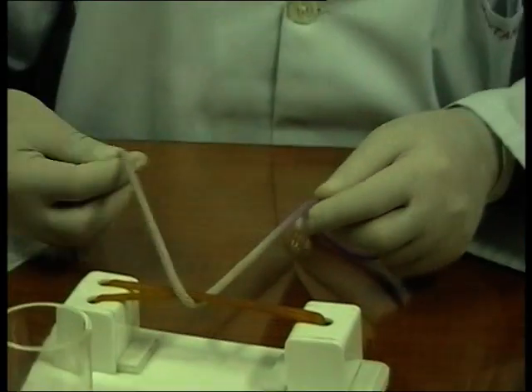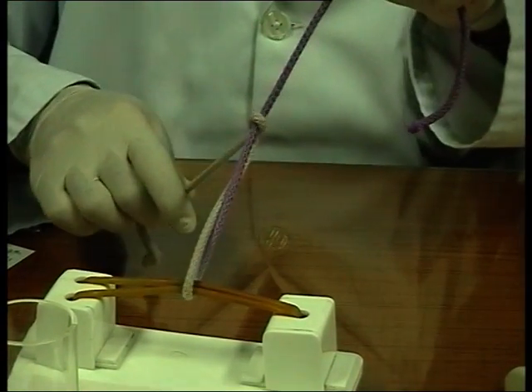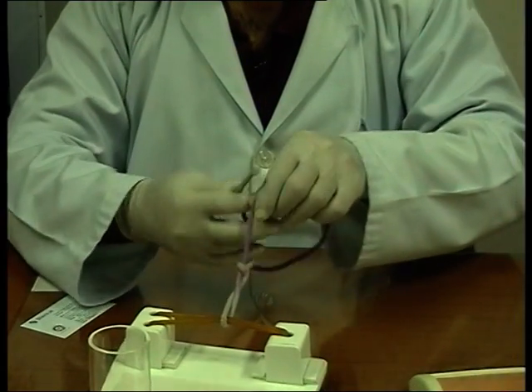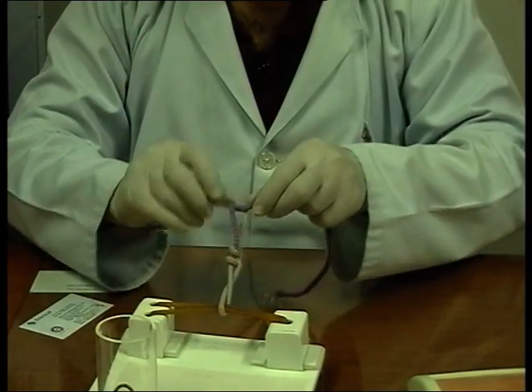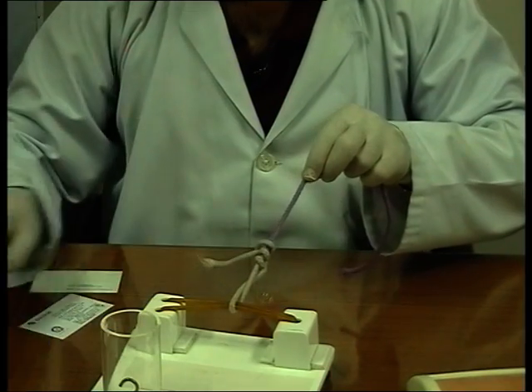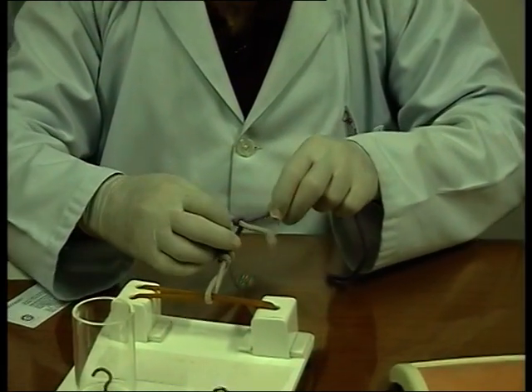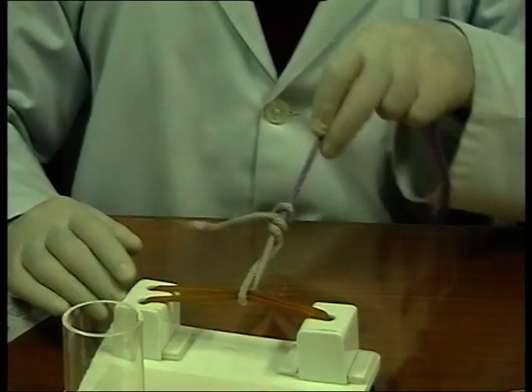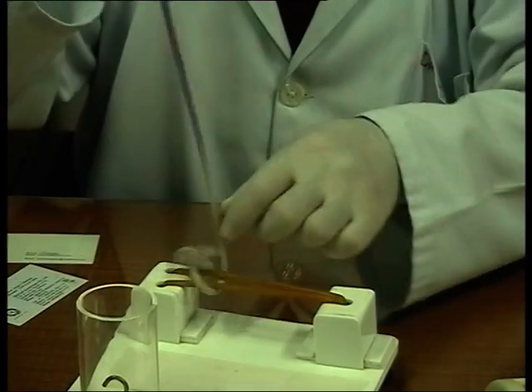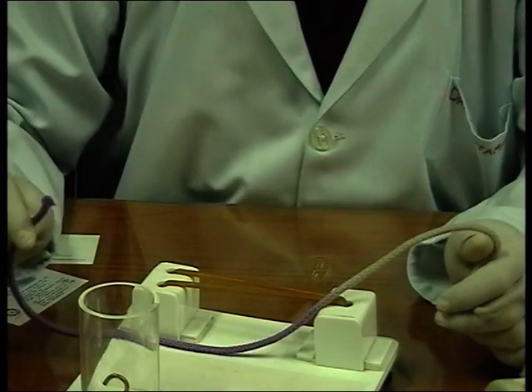Now the short end is the way I should use index and then middle. What do I do here? I just do this. This is the most common knot that you see. See, I've crossed even without putting a throw. And now I put one, I put another, I keep putting, no matter how many, I'm just putting twisted loops around the same straight thread. Now this thread and this thread and this thread are the same. So I'll put 3, 4, 5, and to make everybody happy, I'll put 6 or 7 and say okay, I put 6. But actually if you look at it, this thread can easily be taken out. It is a no-win situation. It's a no knot. The granny knot should not be put.